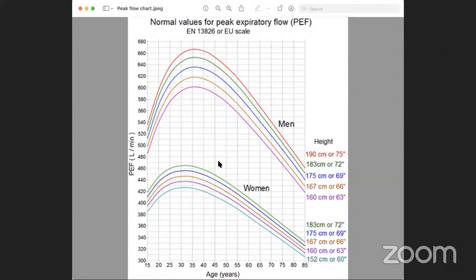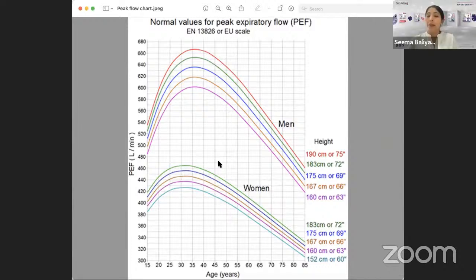Okay. So once you have told the patient and reassured the patient, the next step is the maintenance. We have done the what, why, parts, positions, and procedure. Now we come to the last one, which is our maintenance.